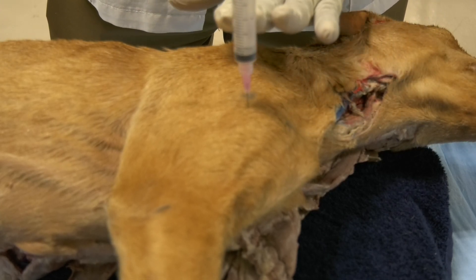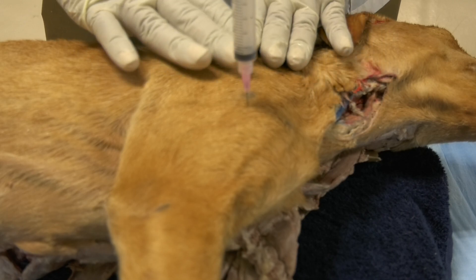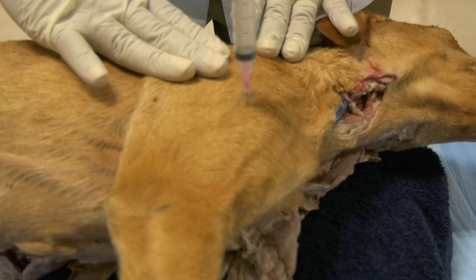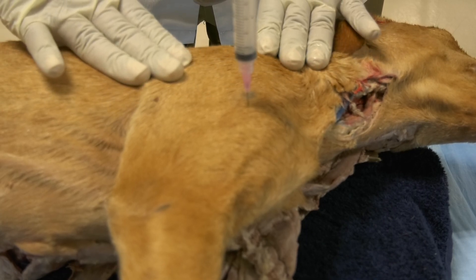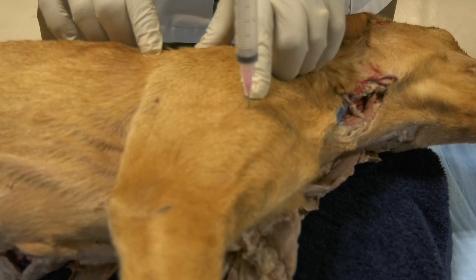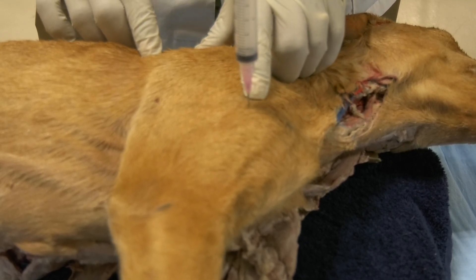When you do that, the shoulder joint has to be in its neutral status — so it is not flexed, it is not extended. Your landmark is the acromion of the scapular spine.